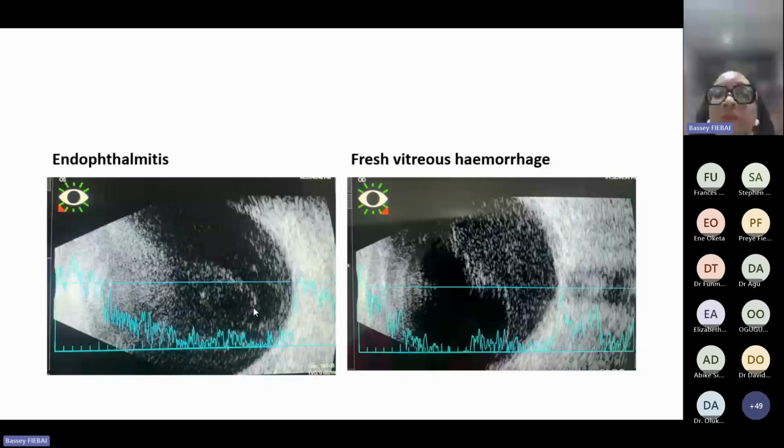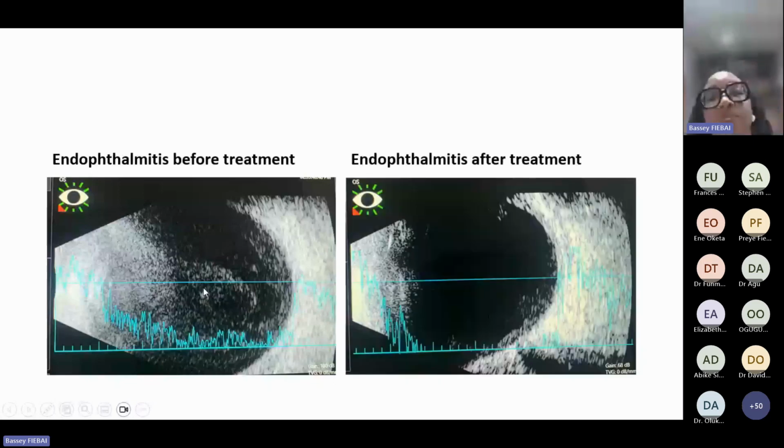But look at how uniformly distributed this is. You could actually confuse the two. You could actually think that this is vitreous hemorrhage as well. So clinical information is very important. Ultrasound scan, like we said, is very important for follow-up studies. This was the same patient, and this was her after treatment, and her vision went from hand movement to 6/6, in fact now it's 6/5. So it's very useful for following up your patients, doing serial scans.